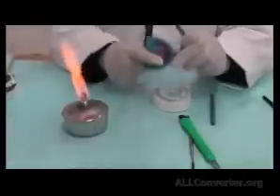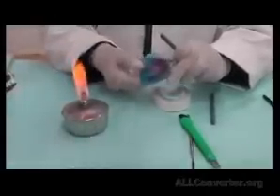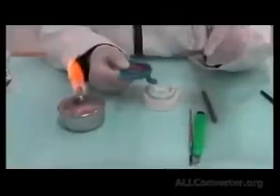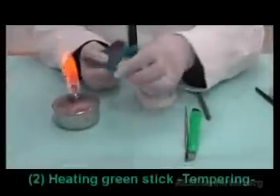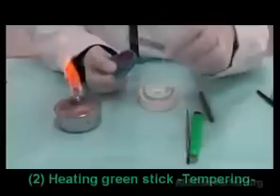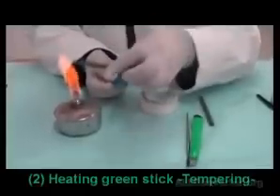If we have tried this in the patient's mouth, we wash away the saliva that might have stuck to it. In the clinical case, we're going to add section by section. We're going to begin by the interior. This makes it easier for student training purposes.